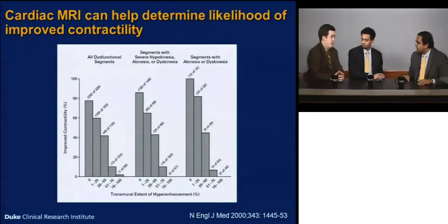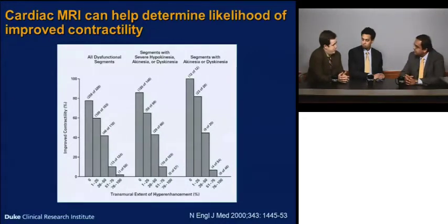Yeah, so I think that it depends on the scenario. Here there are still questions about the chronicity of the occlusions and whether there was viability or not. With the MRI, there were 2 things that happened. One was trying to revascularize percutaneously. That was unsuccessful. But secondly, it was to assess the anterior wall and see whether it would be worth going the next step in terms of bypass surgery, as well as to look at the inferior wall. So here, there appears to be some viability to target those areas.